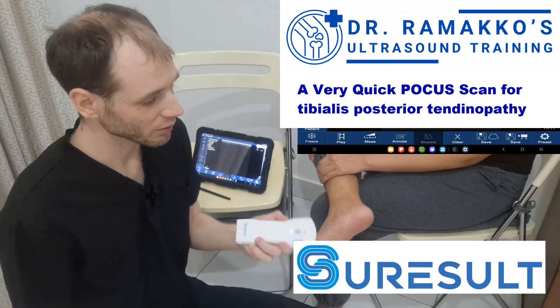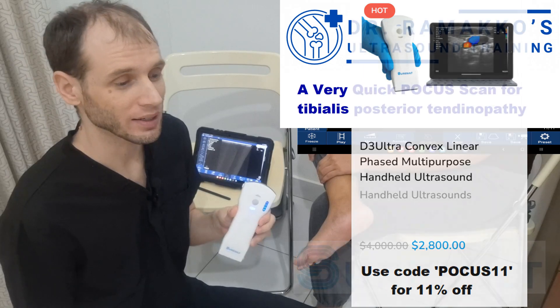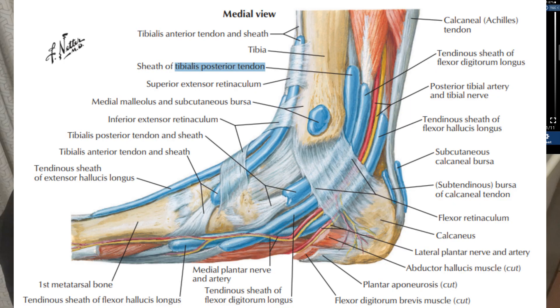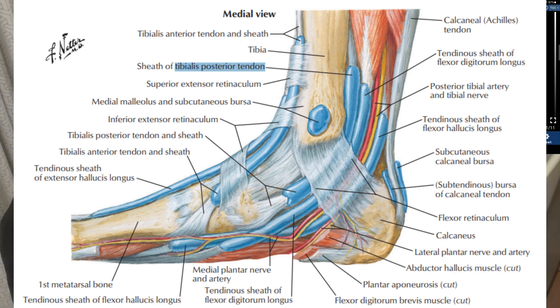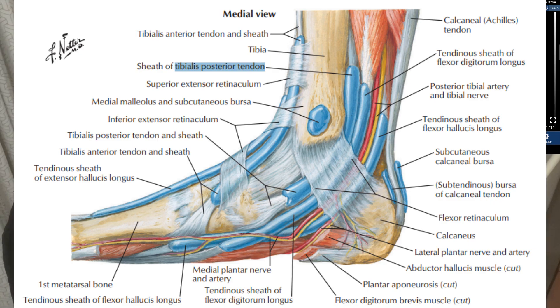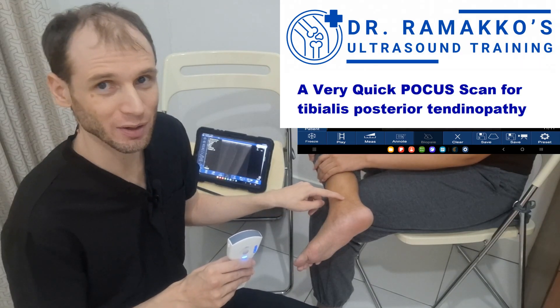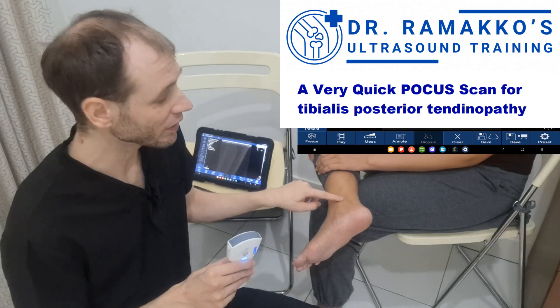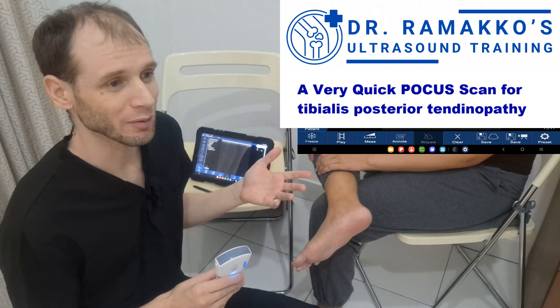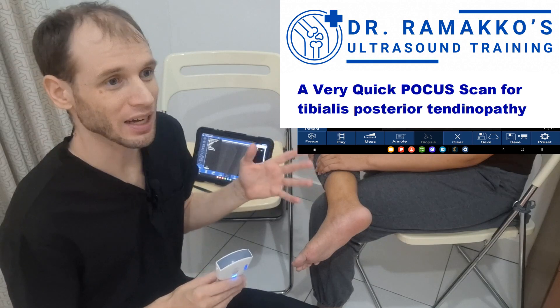My name is Werner Makko and today we're going to use a Sure Result D3 Ultra handheld ultrasound to look for a tendinopathy of the tibialis posterior tendon, also called the posterior tibial tendon. This tendon courses just posterior to the medial malleolus, where the blood flow is a little bit deficient as it bends around the corner — and bending around the corner is typically where it gets injured. It's estimated that about 85% of these pathologies actually get misdiagnosed as something else.